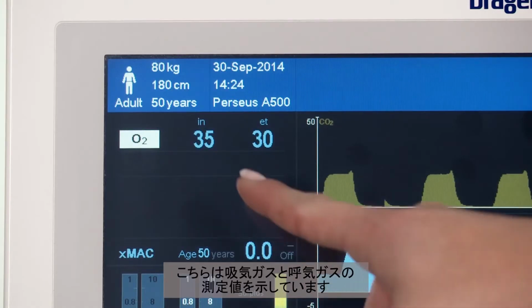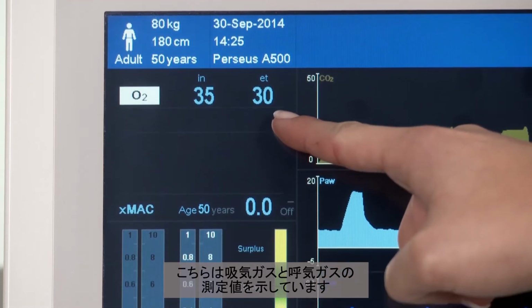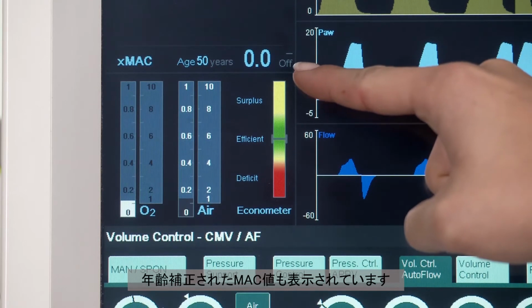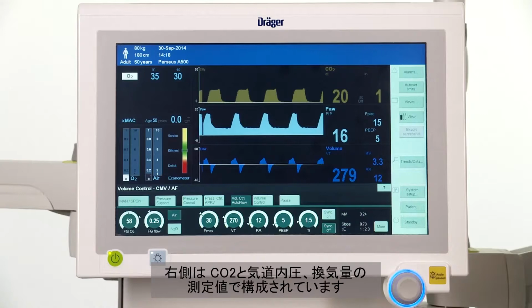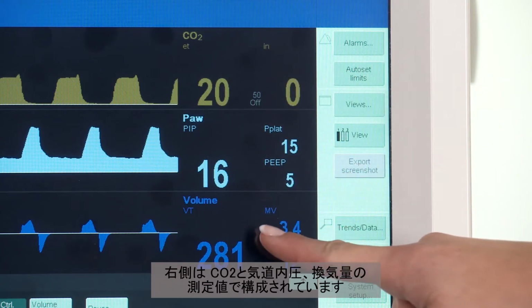This example shows the measured values for the inspiratory and expiratory gas. One of these is the age-adjusted MAC value. This is the location of the virtual flow tubes for the fresh gas flow. The right side comprises measured values for CO2, pressure and volume.